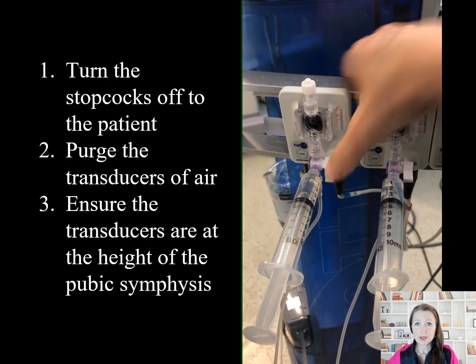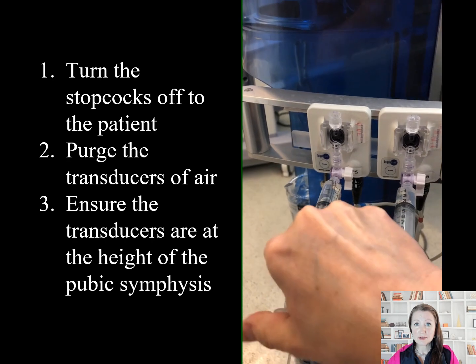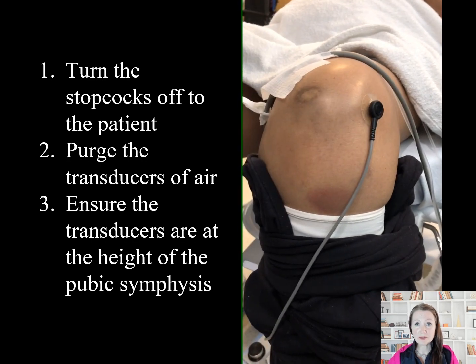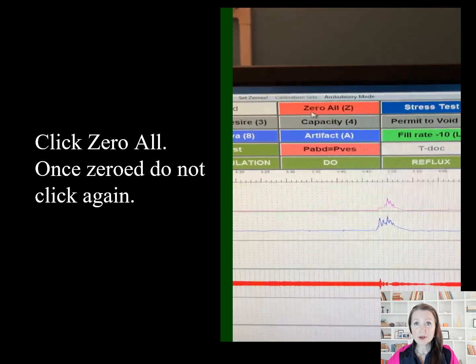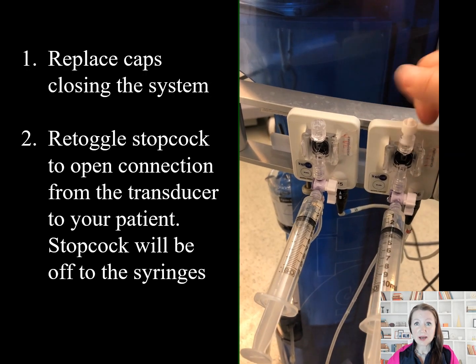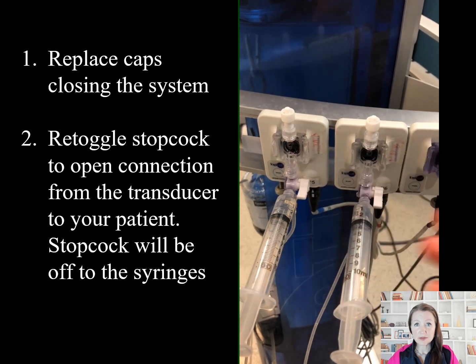Once the catheters are reading well, we zero to atmospheric pressure. We turn the stopcocks off to the patient, purge the transducers of air, and prior to this step, we position the C-arm for the scout image, ensuring that the transducers are at the height of the pubic symphysis. We then click 'zero all.' This button should not be used once the study begins. Once zeroed, we replace the caps and re-toggle the stopcocks to allow the transducer to be open to the patient. The arm is now off to the syringe.